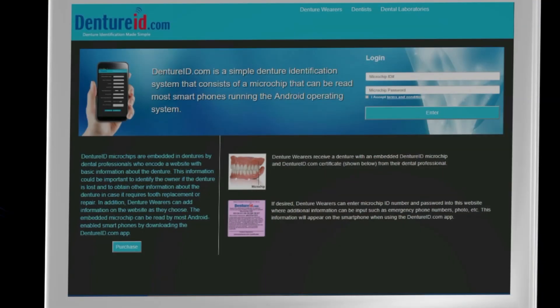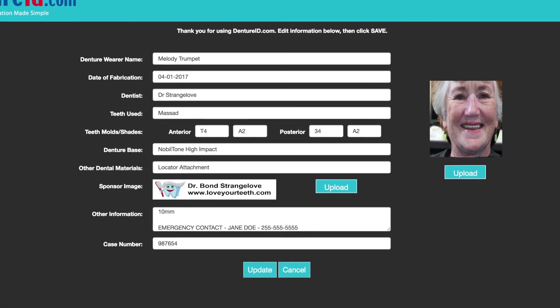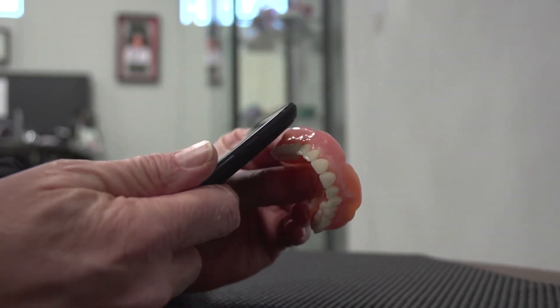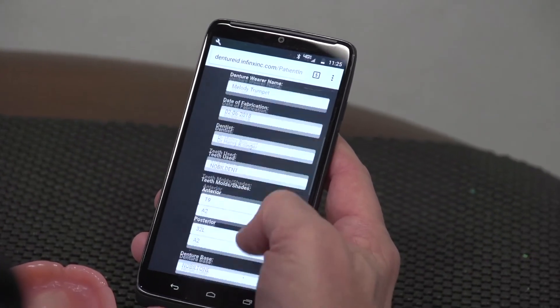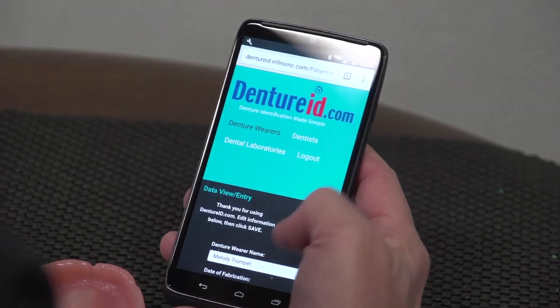Step 4: Enter both the microchip ID number and password into the DentureID.com website. Then enter information about the denture. Then read the microchip embedded in the denture with an Android-enabled smartphone and DentureID.com app to verify that the information displayed on the smartphone matches the information entered on the website.